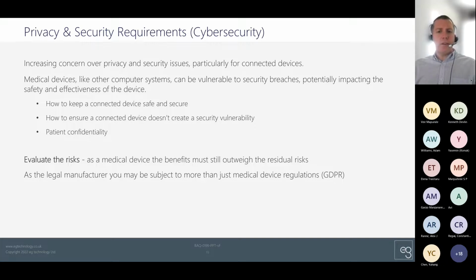How do the updates impact the performance of your software? And careful segregation of the design from the outset can help you ensure that you keep the impact of these changes minimized, and therefore the need for full retest or re-audit, recertification is also minimized to only those times when it is truly appropriate.